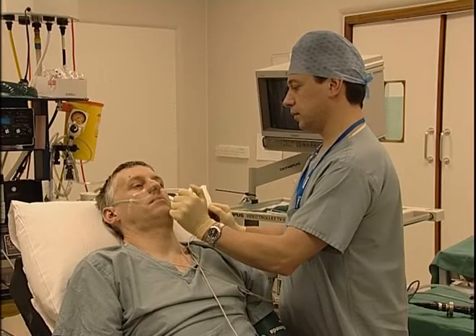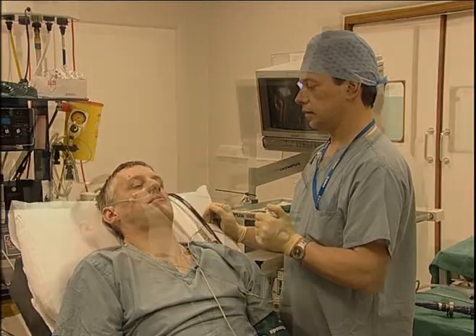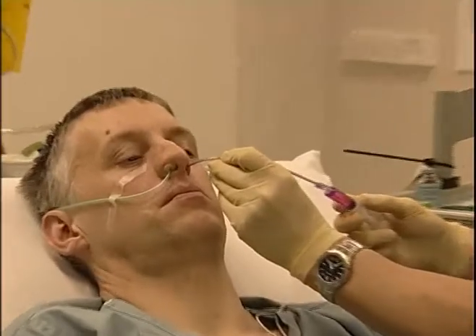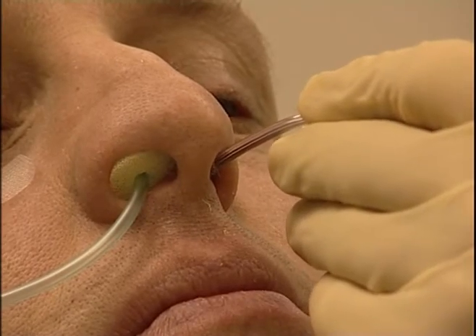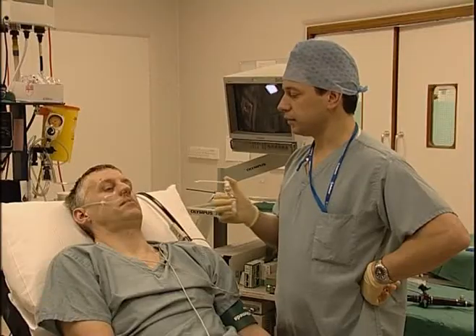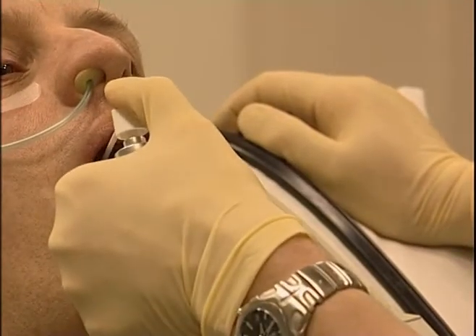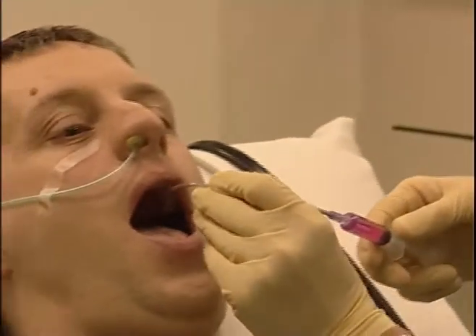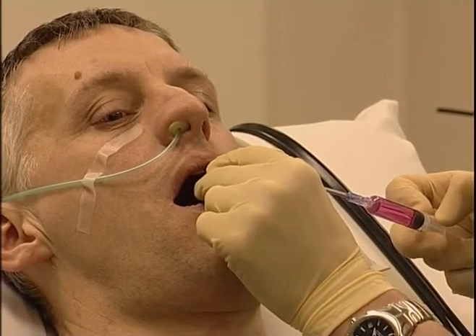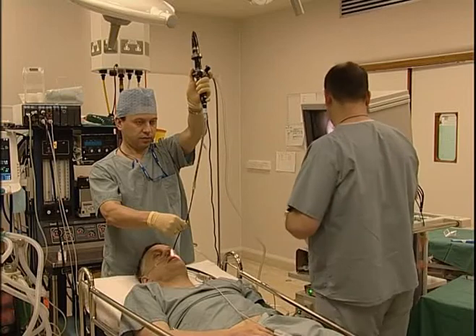The chosen nostril is then anaesthetized using 5% lidocaine with 0.5% phenylephrine. To achieve deeper spread of local anaesthetic down the nostril and nasopharynx, a mucosal atomization device is used, containing three to four mils of 4% lidocaine. The next step is to spray local anaesthetic — usually 10% lidocaine — at the back of the tongue to obtund the gag reflex, four puffs each side. The mucosal atomization device is then used again to propel 4% lidocaine towards the posterior pharyngeal wall and larynx.